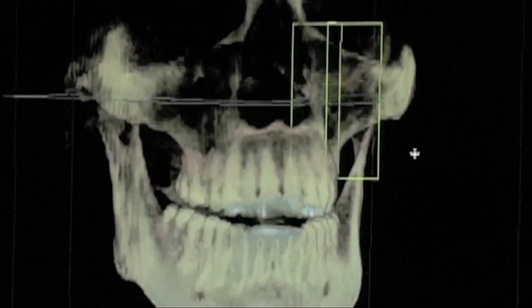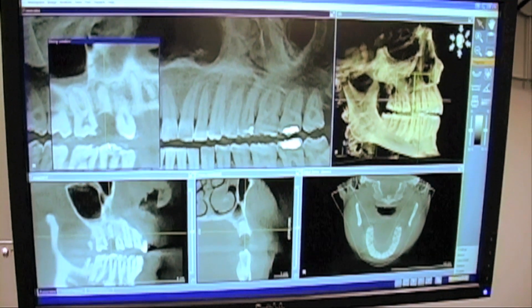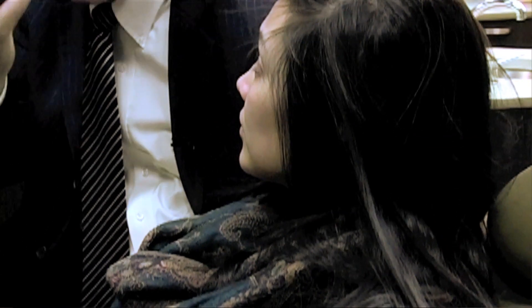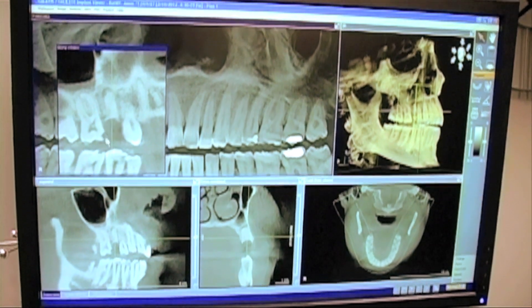So now what we're going to do is go ahead and perform the virtual surgery, which means we're going to take this tooth out and put an implant in. Then we're going to place what we call an implant abutment — it's like a prepared tooth — and a temporary crown at the same time. Everything is going to be done virtually and planned in advance.